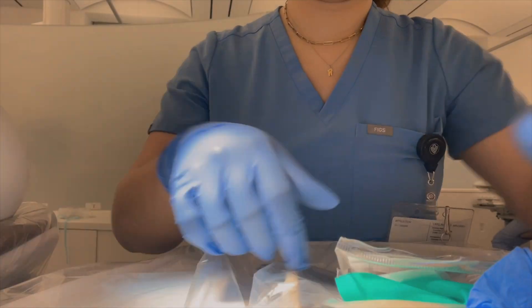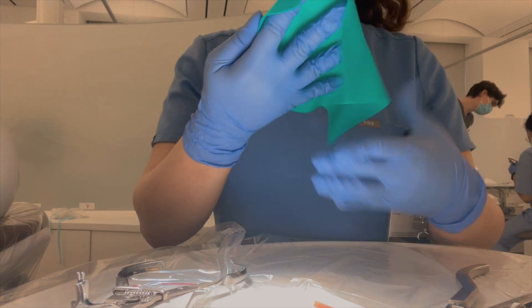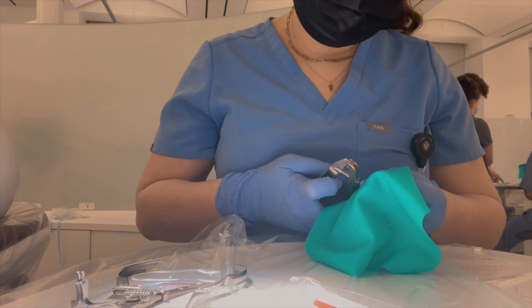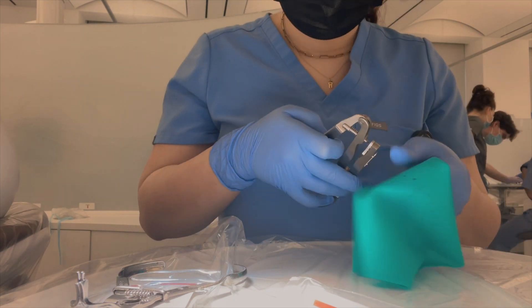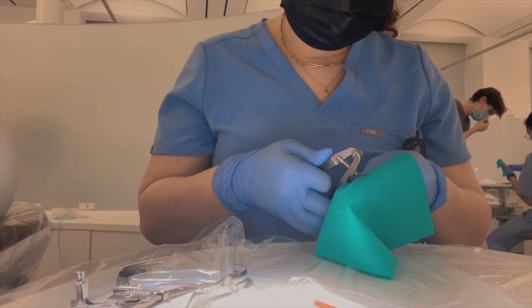Because for most of us it was our very first time ever handling one and using the clamps and all the instruments, it was a very challenging time. The good thing is our school made it easier by providing a stamp that puts dots in every quadrant, so we know where to punch holes to place the dam on which tooth. For our assignment, because we're working on class ones right now, our instructors had us do an entire lower quadrant — either half of the mandible, working on tooth number 19 or number 30.